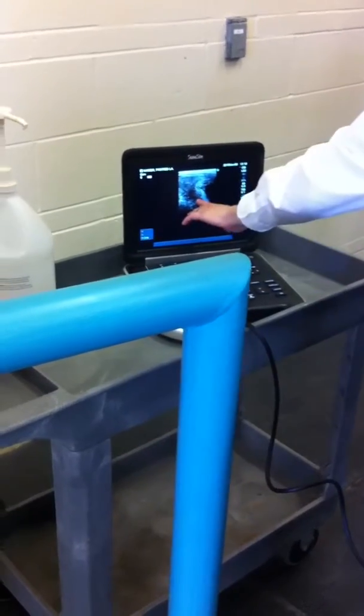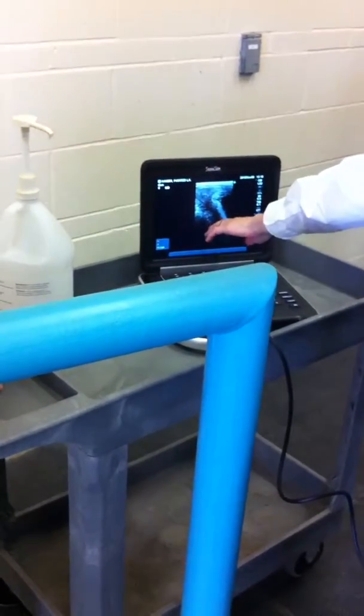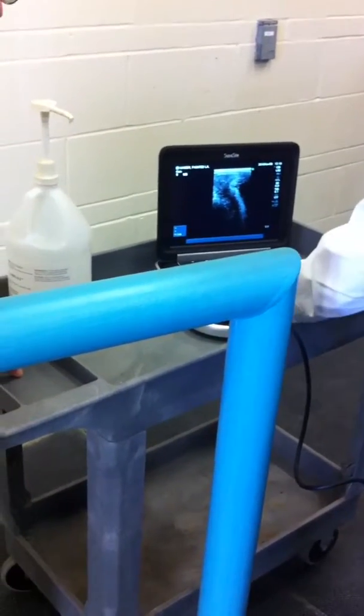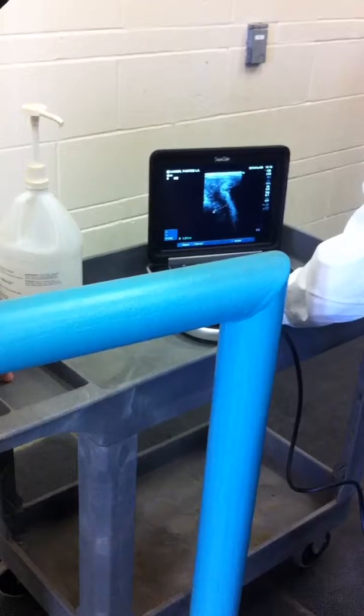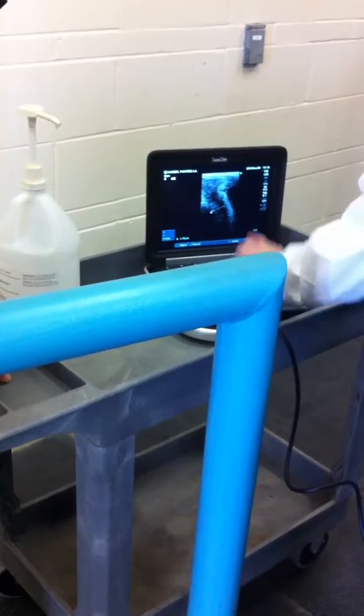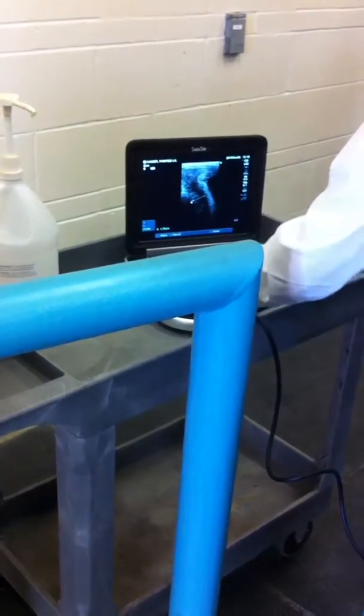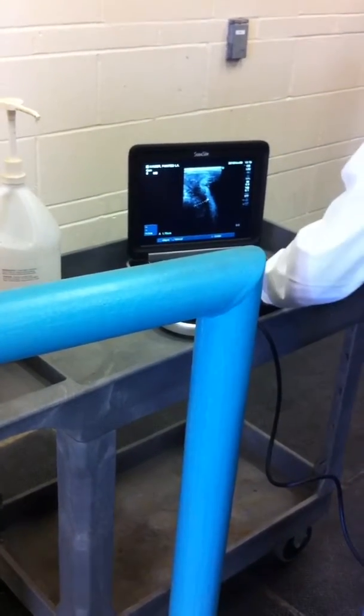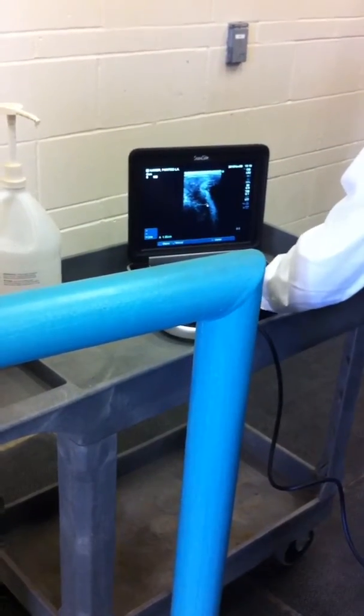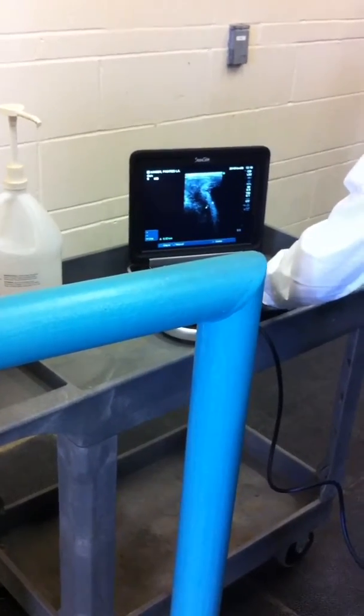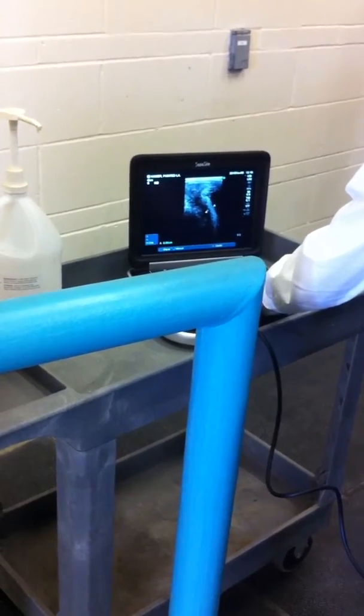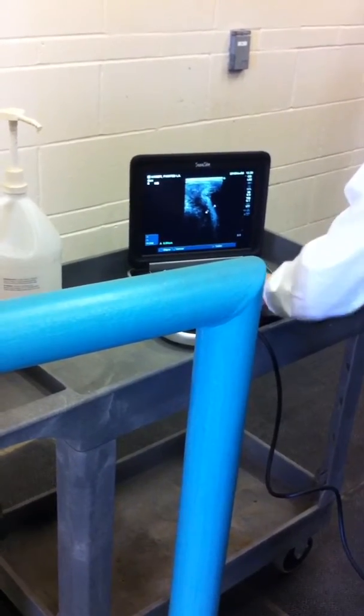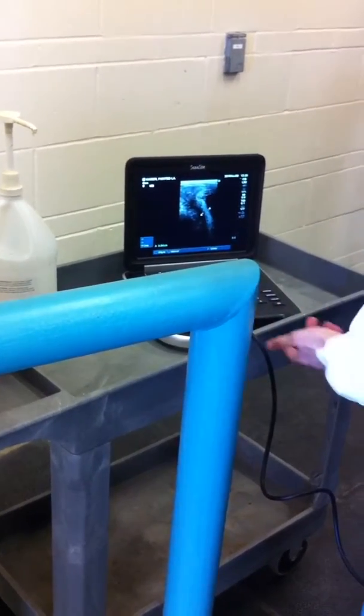So here's the cranial vaginal artery. The black thing to the left, and then this is the combined thickness of the uterine wall, and it is 0.9.